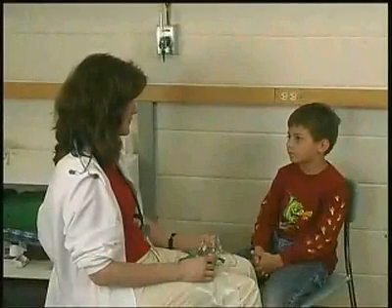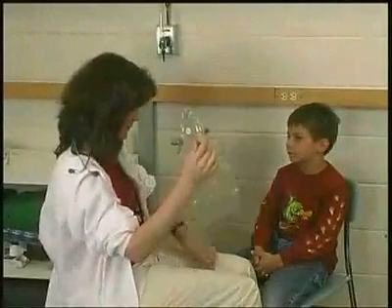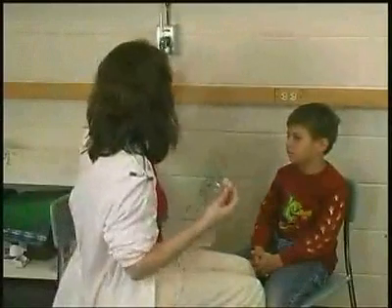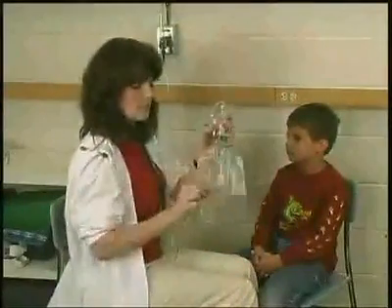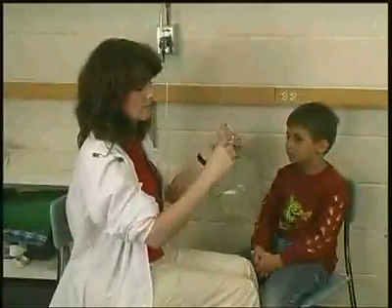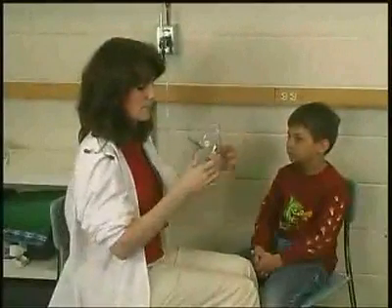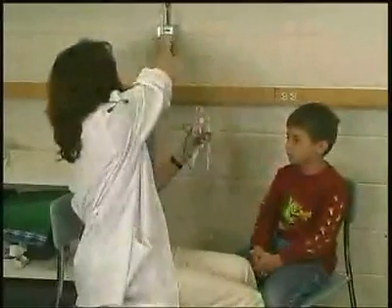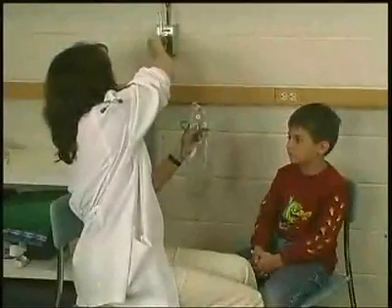The non-rebreather mask delivers the highest oxygen concentration of the low flow devices due to the oxygen reservoir and one-way valves that force the patient to breathe mainly from the oxygen-filled reservoir. The flow rate should be adjusted so the bag does not deflate more than one-third on maximum inspiration.